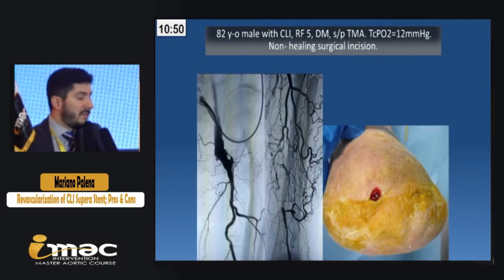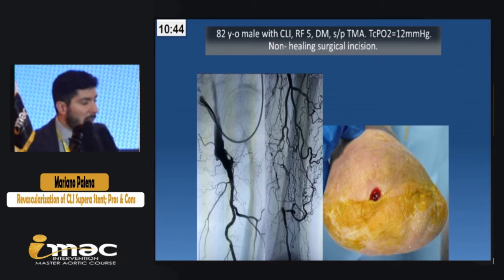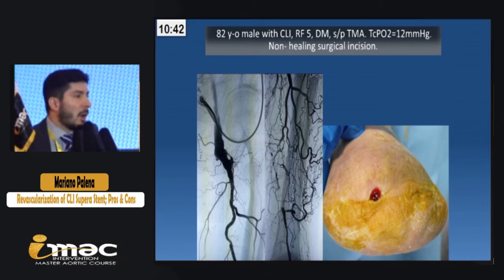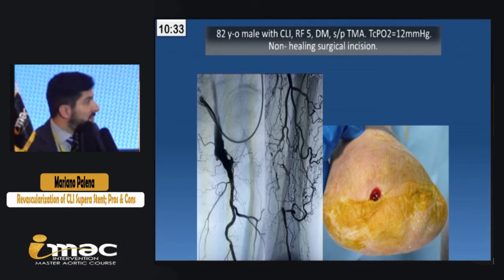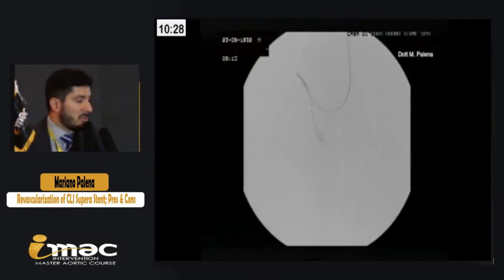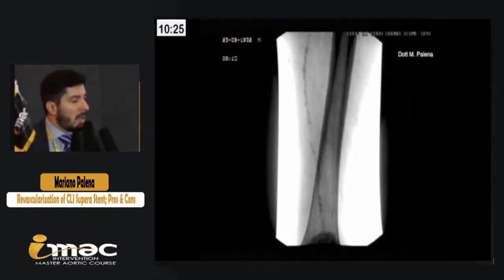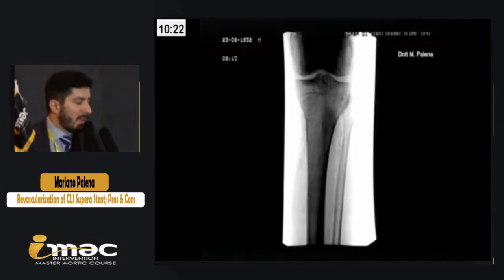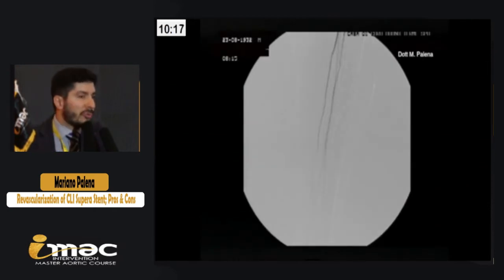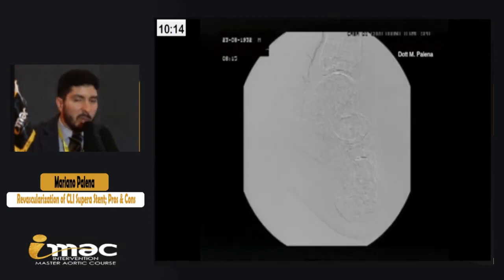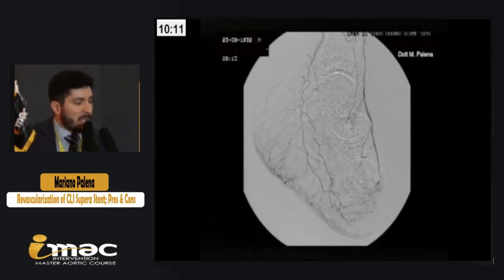A different situation in a different patient: a patient with a previously amputated transmetatarsal amputation that is unable to heal, already treated by open surgery with thrombendarterectomy of the common femoral plus profundoplasty, and already treated in the proximal SFA. There is an occluded stent in the proximal SFA. Again, a 6 French antegrade sheath, long occlusion of the SFA with multiple calcifications, stenosis in P2, but relatively good runoff — posterior tibial and peroneal artery, good flow for the foot. So the main focus here was the SFA.